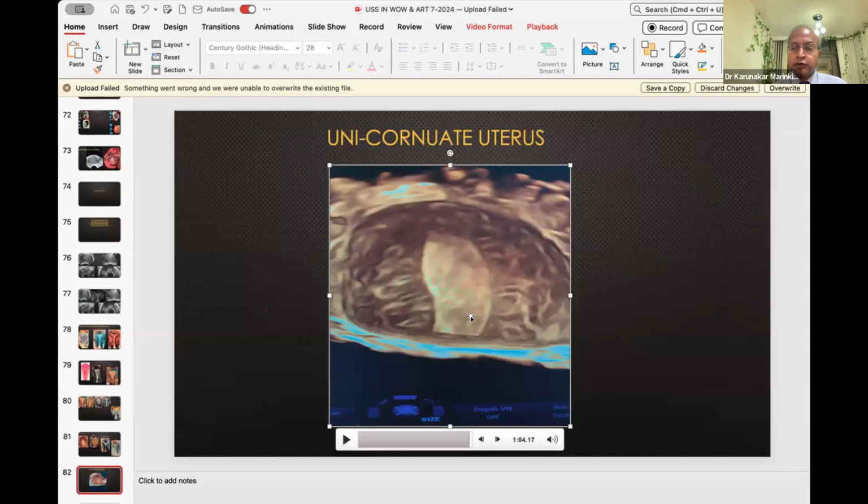Obviously, this is the case. She came for it. So what was my concern? I did put a stitch, then she had another baby, boy gender. But the point is not to diagnose unicornuate uterus, right? Or maybe the patient was not told. It's very unlikely a surgeon missed a unicornuate uterus, or he might have thought it was not relevant. But cervical incompetency was not prevented. So she had an elective non-pregnancy cervical cerclage. That's one point I want to mention from this.